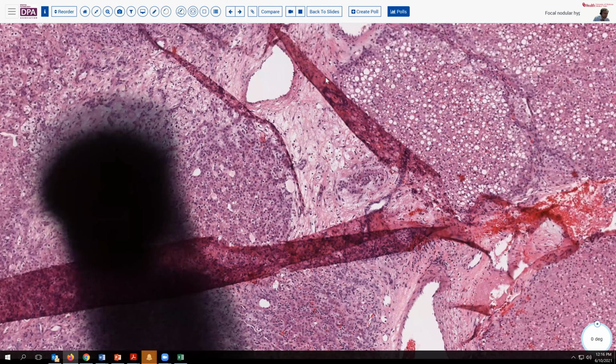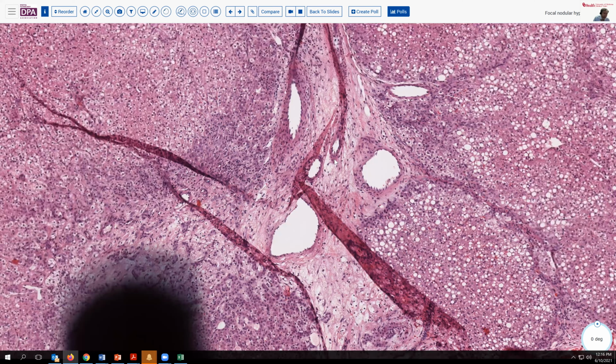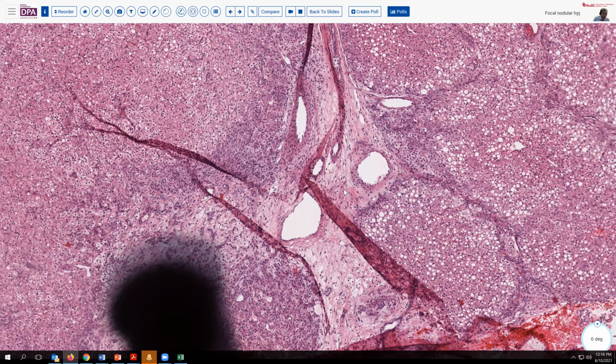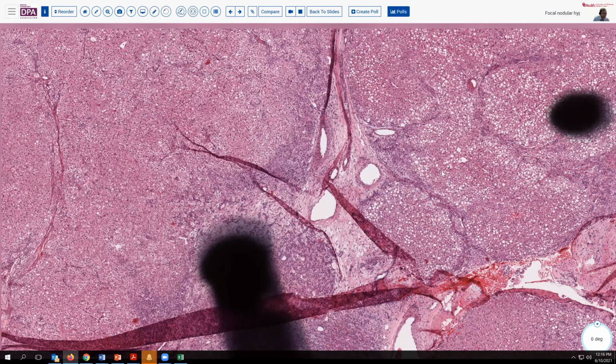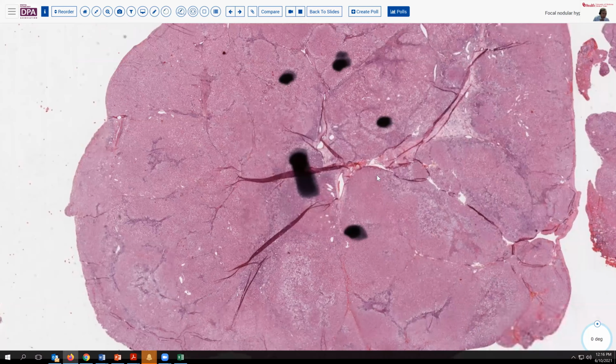So this doesn't fit particularly well with an adenoma, and this is the central scarred area with, again, these somewhat odd vessels. Notice here we have a little bit of steatotic change. Sometimes this can be florid, and just, this is the only area that's showing steatosis. Sometimes it's identical to the surrounding tissues.